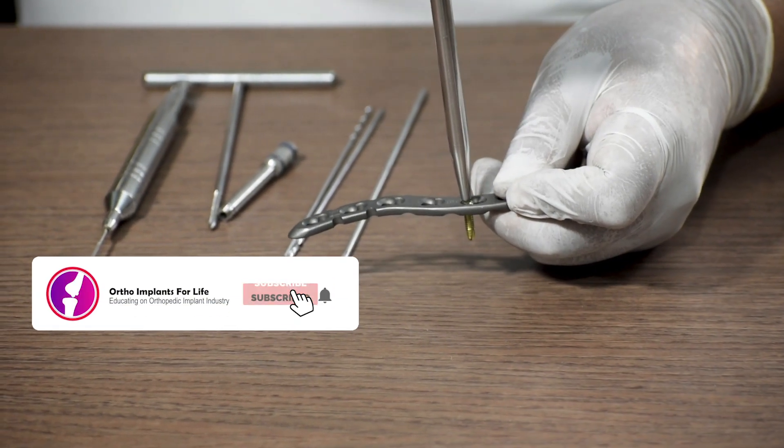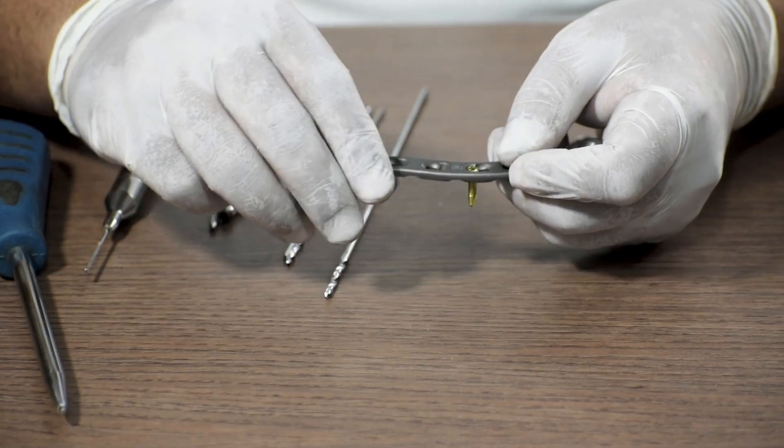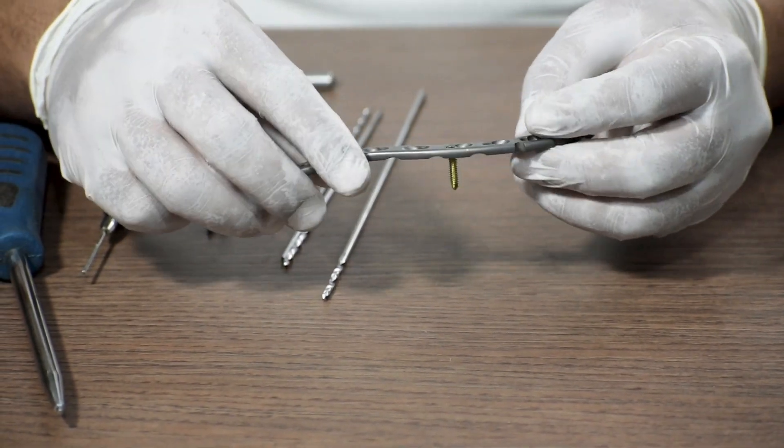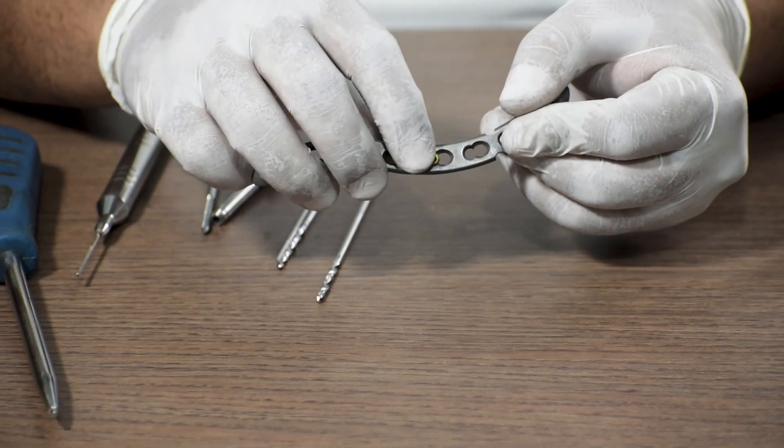As you already know, a locking screw gets locked in both the plate and the bone. This portion gets locked in the bone, and the head of the screw gets locked in the plate.